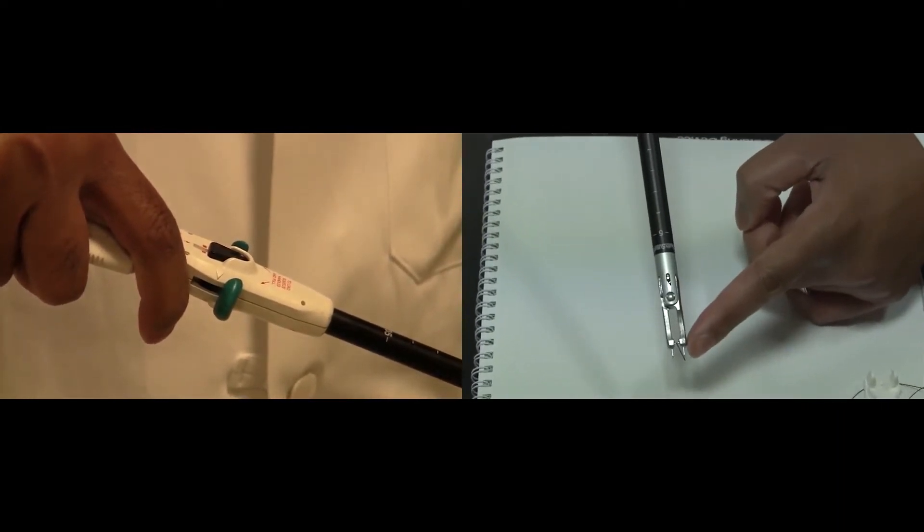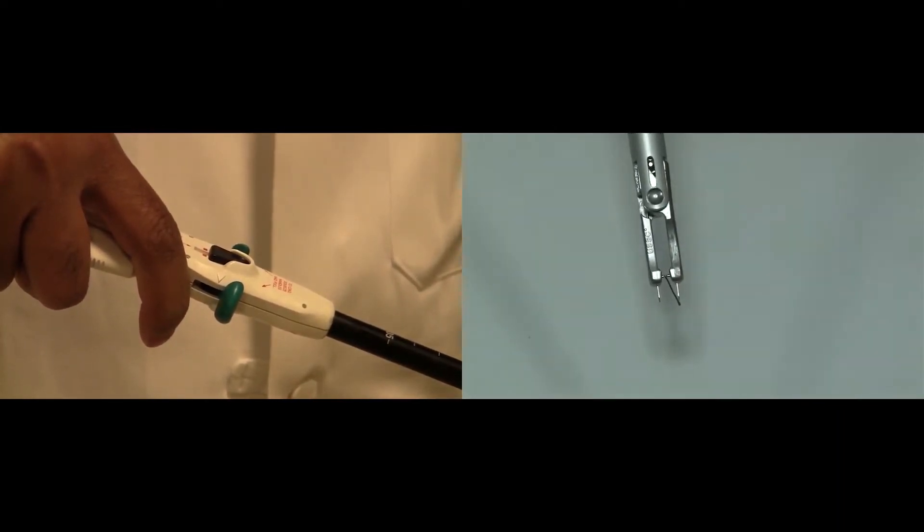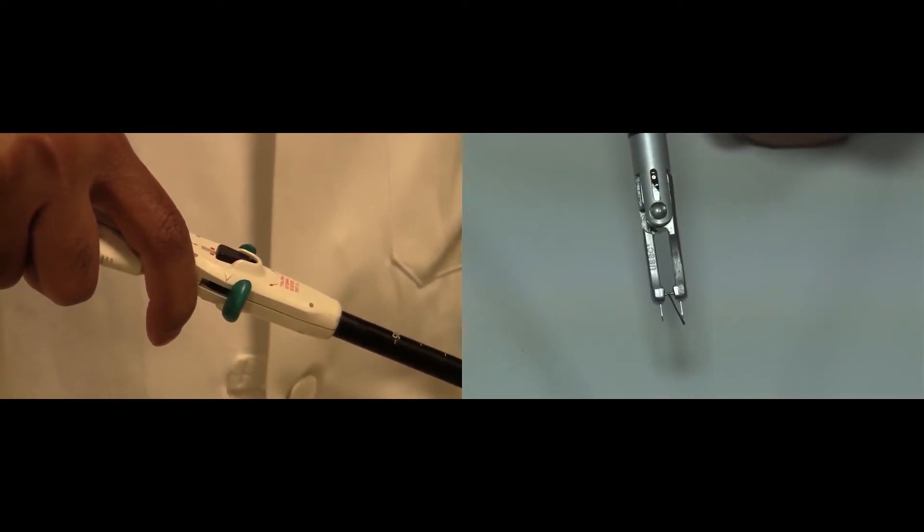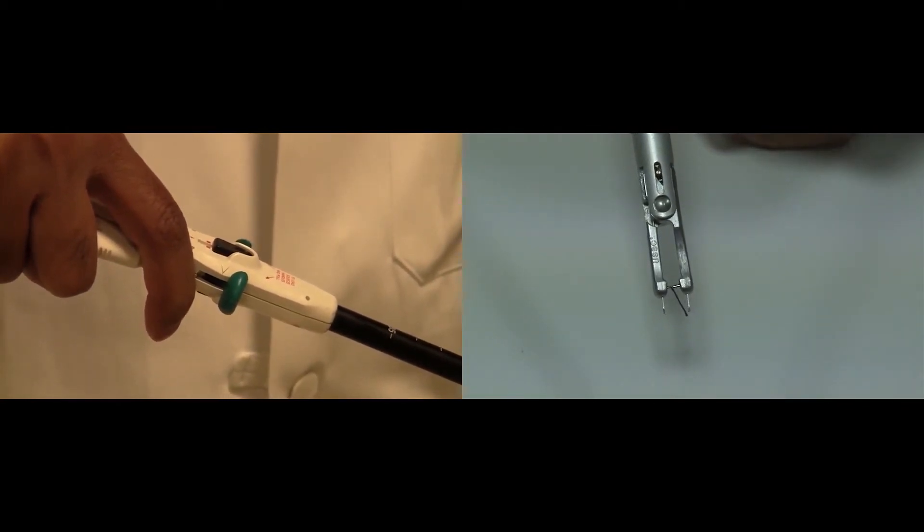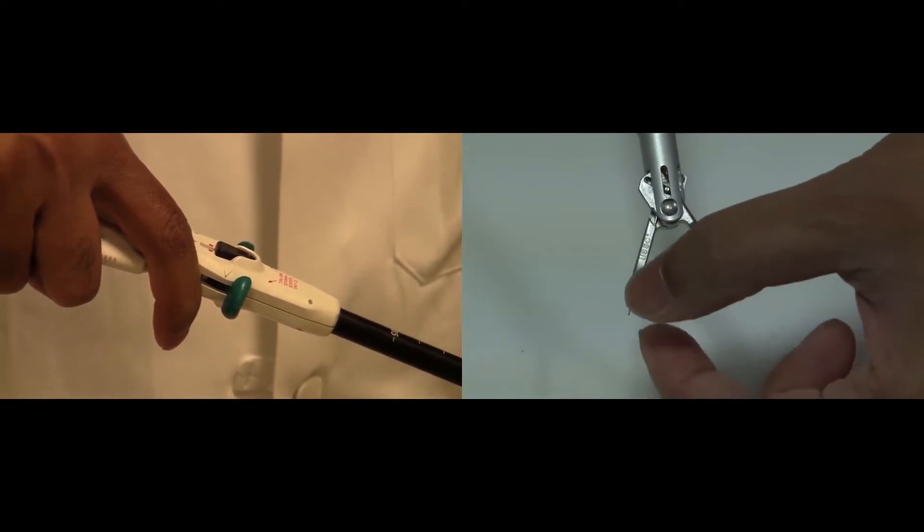Once these two prongs are sticking out of the device, the needle is free. Simply open the device up and remove the needle from the suturing device.